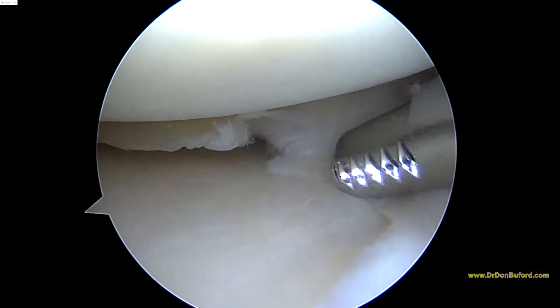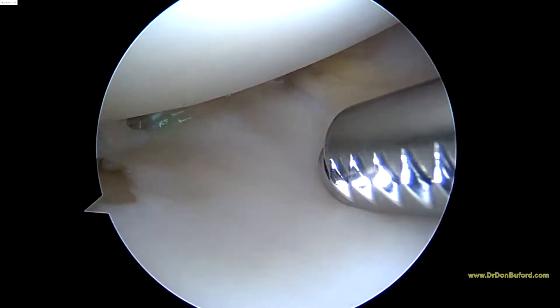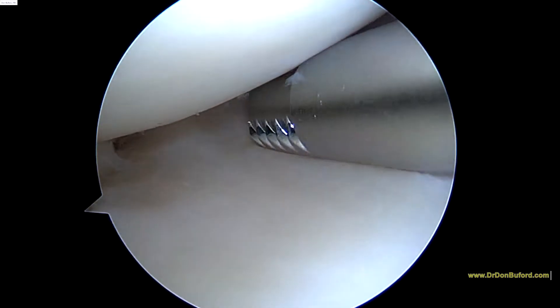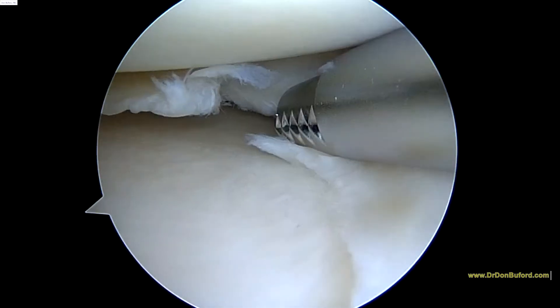There's really not any vascularity there, so I can't really put a stitch in that and reliably expect that to heal. The tears that occur along the capsular margin — these tears can heal. But as soon as you get out on the inner edge, these tears do not heal.